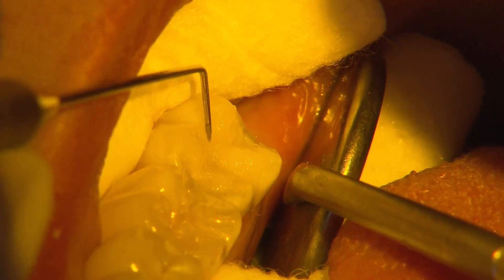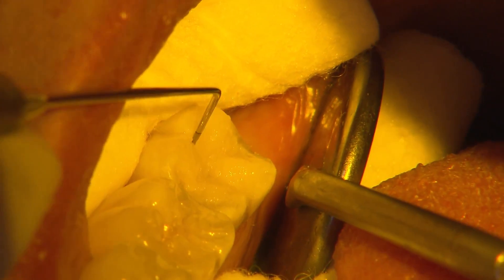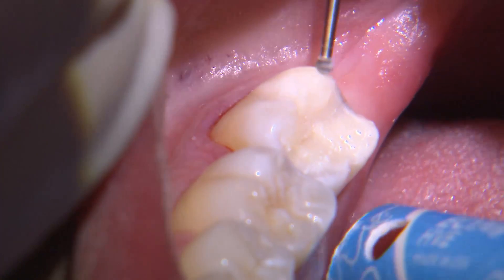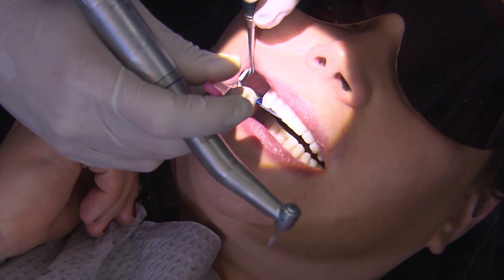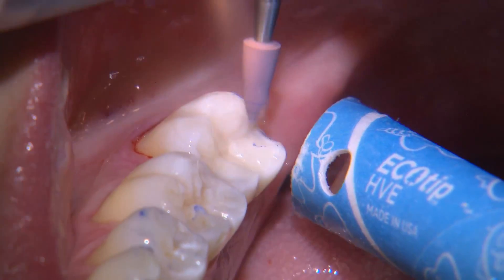I use an explorer to define the primary anatomy between each cusp slope. With a slow speed round burr, I'll remove any excess along the margins and adjust any high occlusal spots. I then finish with some rubber tip composite polishers to achieve a smooth surface.